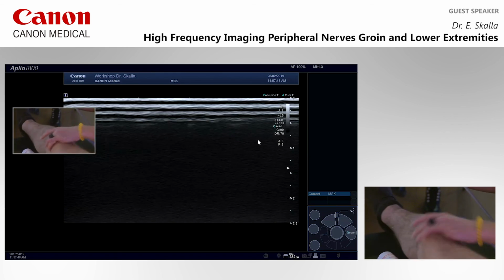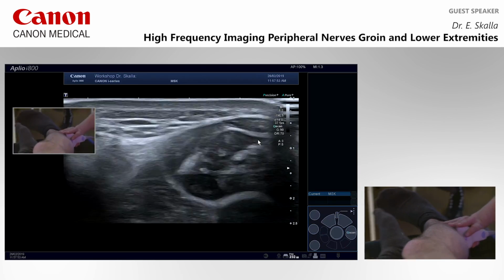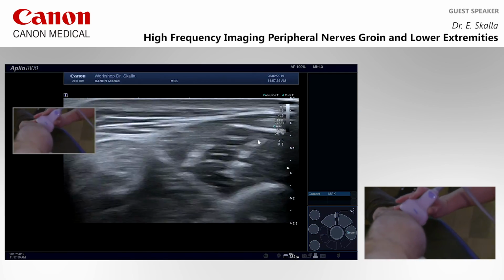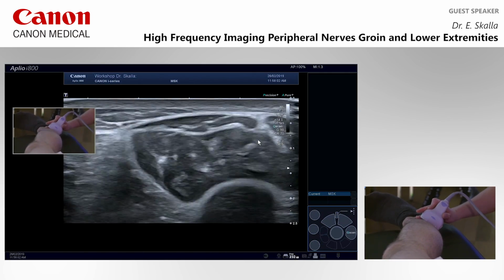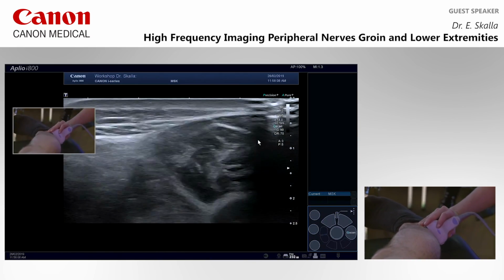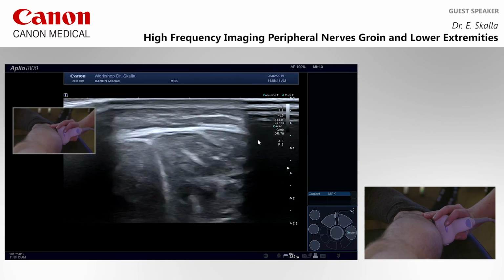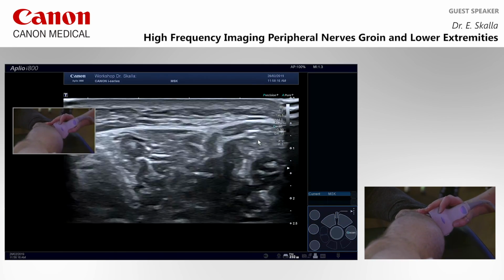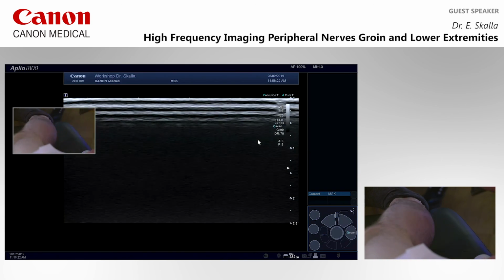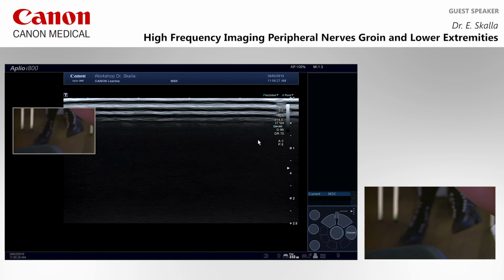So just turn inside a little bit, and we will search the sural nerve. So, proximal of the lateral ankle. Anywhere there has to be the small saphenous vein, but it isn't here. It's easier to turn the patient on the stomach.